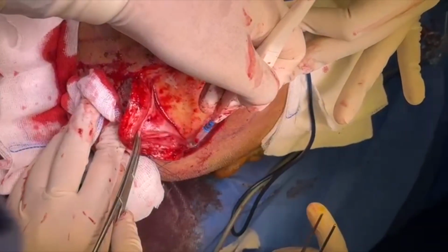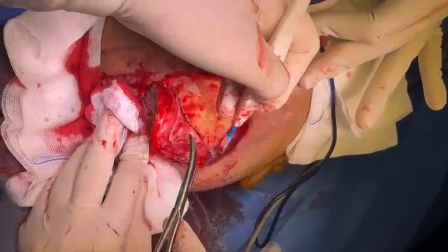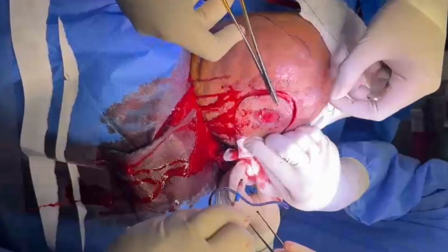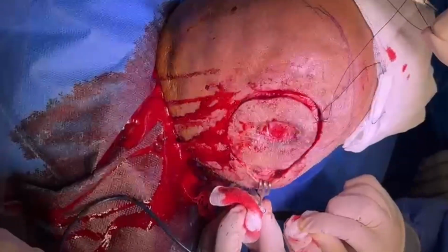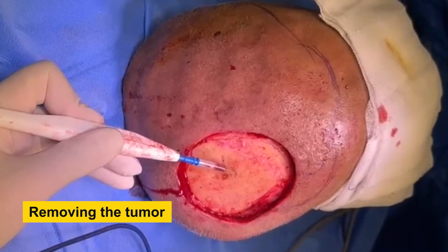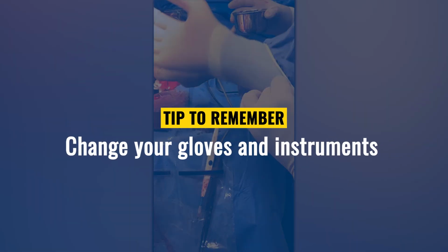Once periosteum is elevated, then the tumor can be excised from all the other margins. Always place marking suture before removing the tumor fully. Then remove the tumor. It's always a good idea to burn the bone just below the tumor area. Before reconstruction, change your gloves and the instruments.